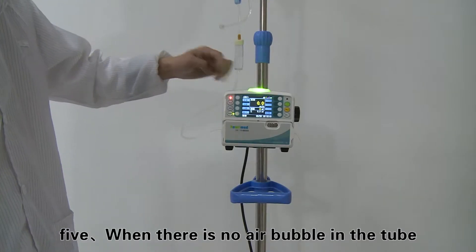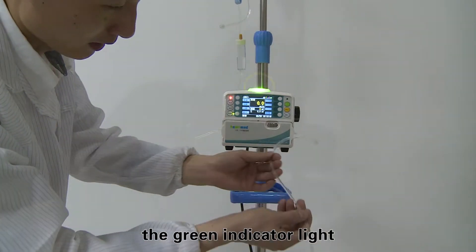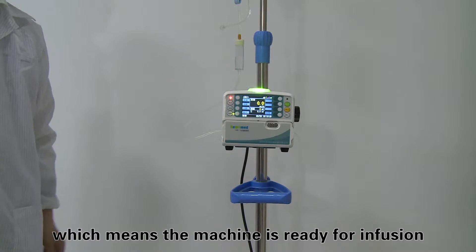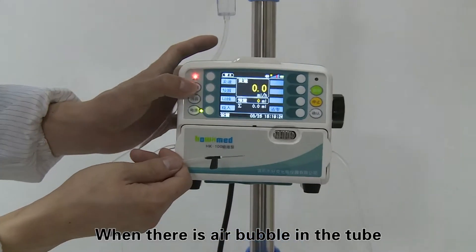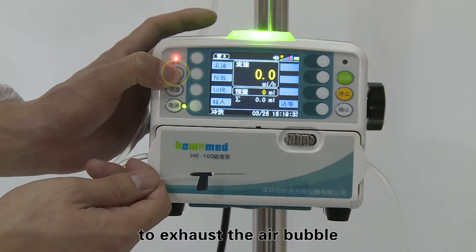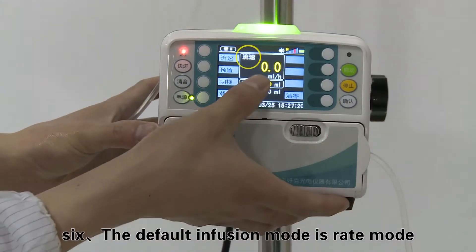Step five: when there is no air bubble in the tube, the green indicator light will be on after proper installation of the IV set, which means the machine is ready for infusion. When there is an air bubble in the tube, the green indicator light will not be on. Keep pressing the bolus key to exhaust the air bubble.